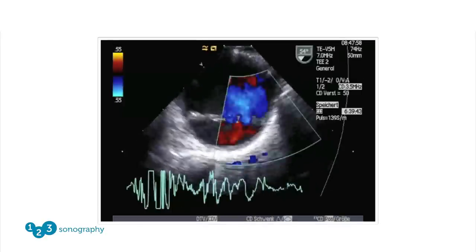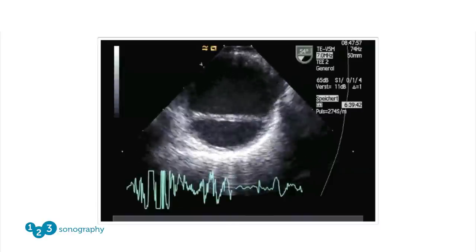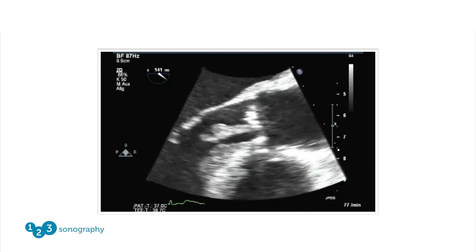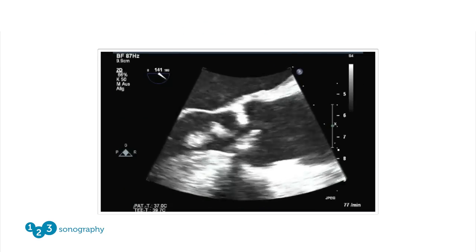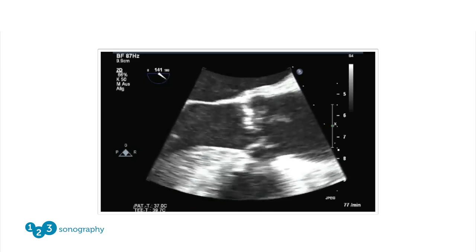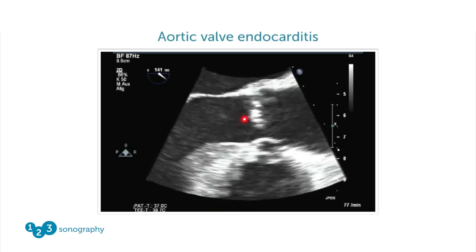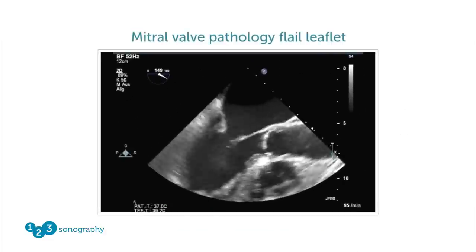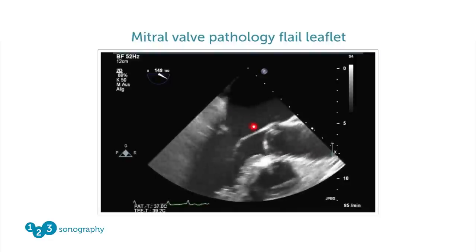Another advantage is that we can see the aorta — a beautiful example of aortic dissection. One of the major advantages of TEE is to diagnose vegetations, in other words, endocarditis. This is a large mobile structure on a calcified aortic valve. TEE has greatly expanded our diagnostic potential for diagnosing endocarditis.